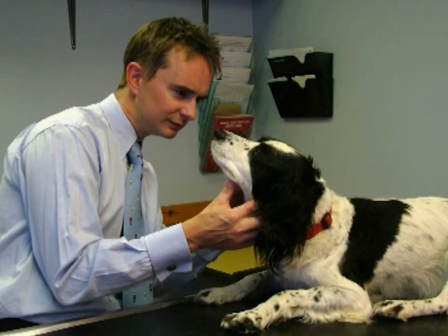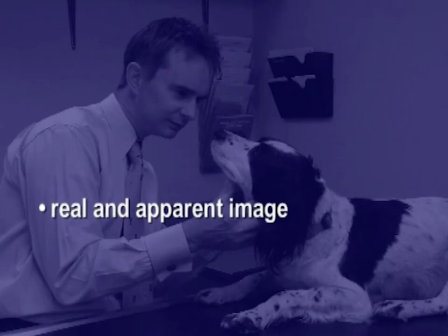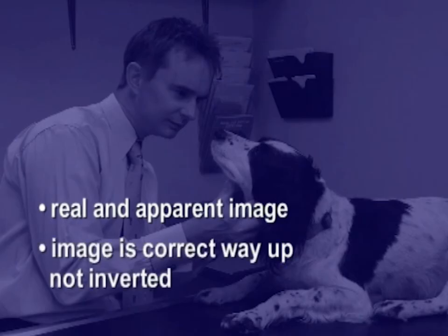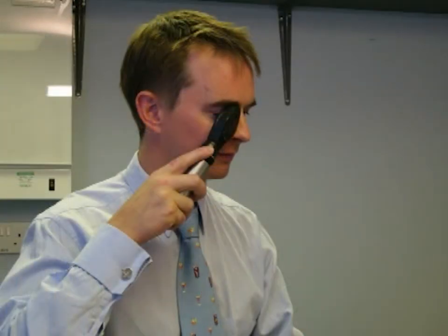The direct ophthalmoscope will give the user a real and apparent image, which means that the image seen is the correct way up and not inverted. The instrument is designed to be held with the head of the ophthalmoscope fitted into the user's orbit. Ideally, the instrument would be held in, for example, the left hand and fitted into the left orbit of the operator, or in the right hand for the right orbit.